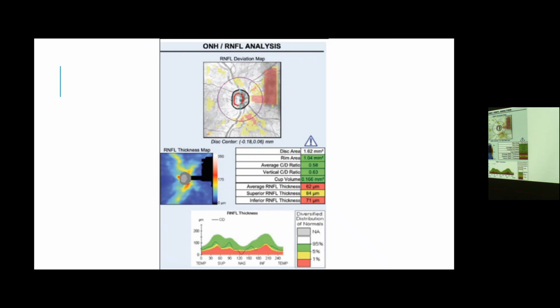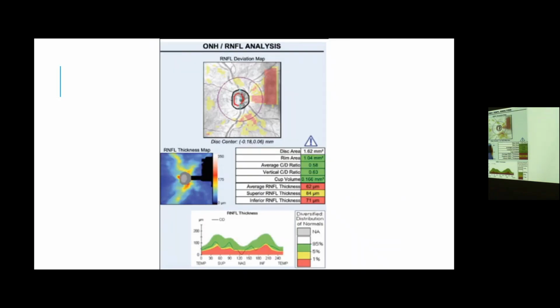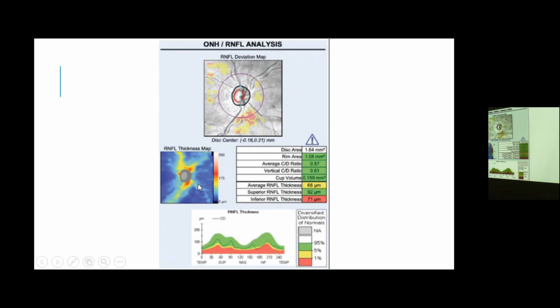Still poor, they will keep it. It depends on the clinical picture of the patient. If the patient has mild cupping, not glaucomatous, you can repeat if we get an image like this. It's good. If we could not, we can just follow the patient and repeat again at a different time. As we mentioned, anything can affect the image. We have even dryness, patient moving his eyes, blinking, whatever. Yeah. Small pupil.